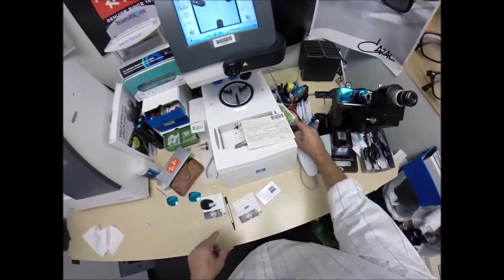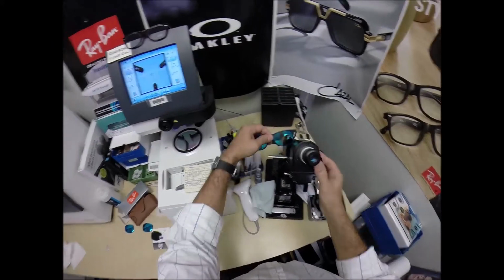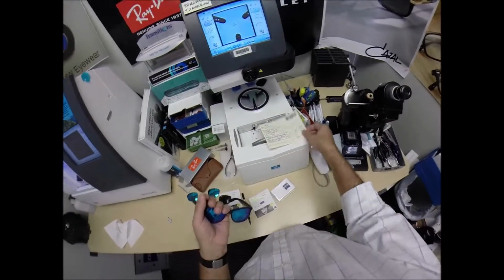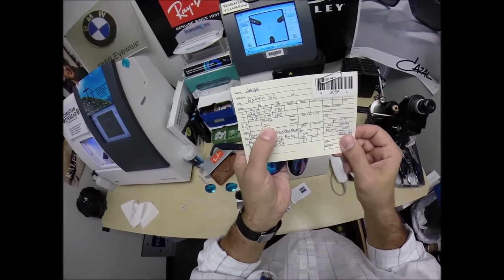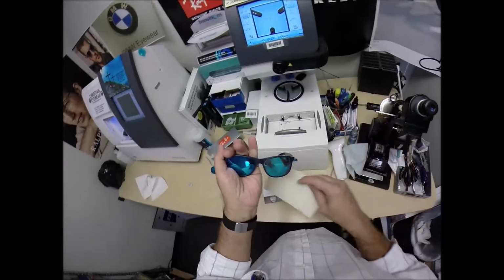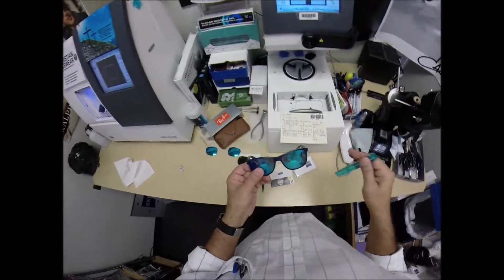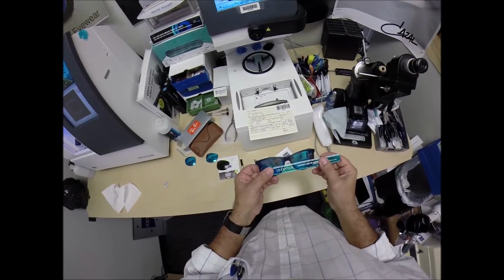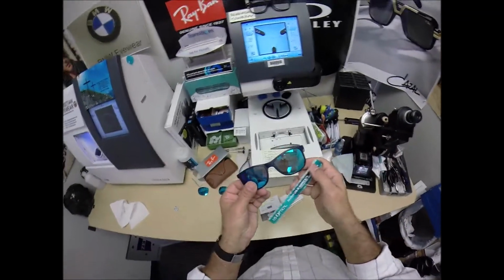All right, flashlight, don't bail on me now. Put a dot on there. Now your pupillary distance is 32.5 for each eye, which is a total of 65. Optical center height of 24. I'm going to turn the card around, place the PD, well actually, don't need that now. You guys can't see, but I'm going to measure. We're getting 65 millimeters, so that is cut perfectly.